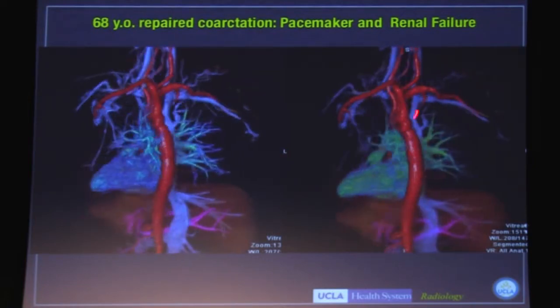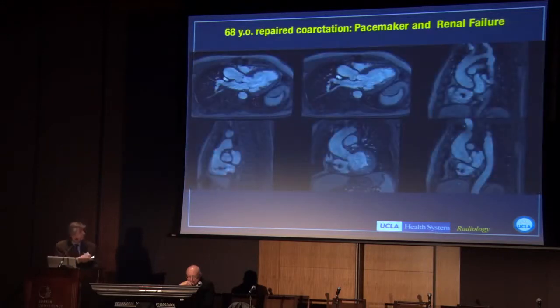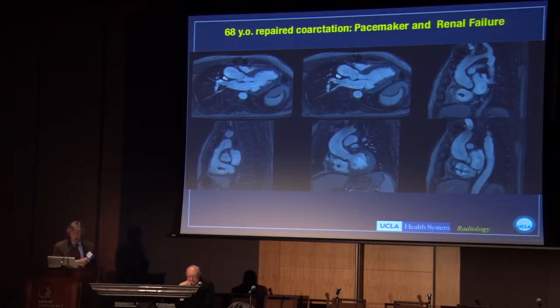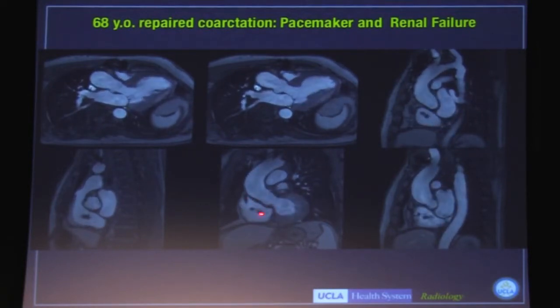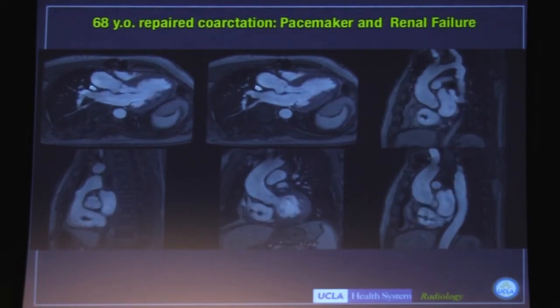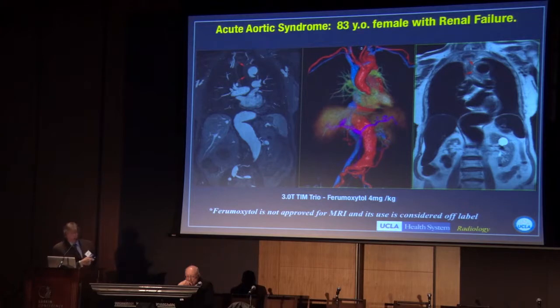Here you can see the residue of the coarctation. As I mentioned, this patient had a pacemaker. Pierangelo mentioned the artifact seen in patients with pacemakers on CINE, but with ferumoxytol — or Feraheme — we can make that go away. Here we can see the leads with almost no artifact and really beautiful definition of the myocardium. Here's an 83-year-old patient who was claustrophobic with an acute aortic syndrome, and we did this study in about 10 minutes with ferumoxytol — she also had renal failure.